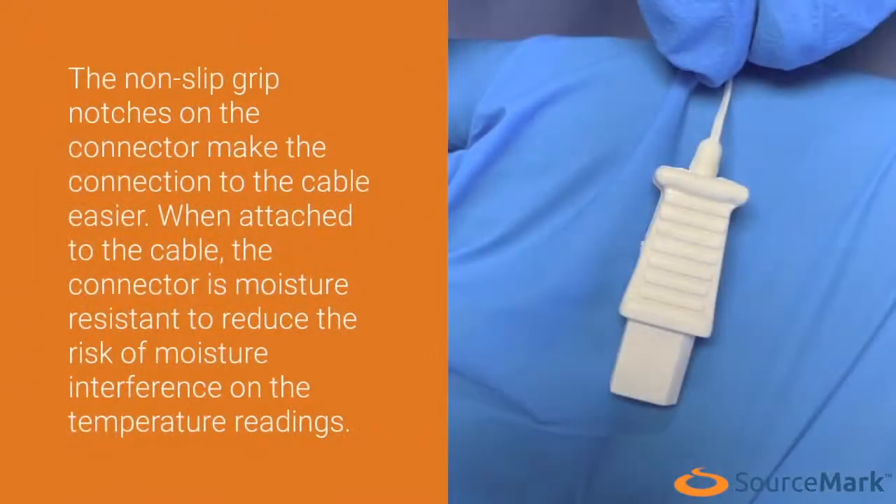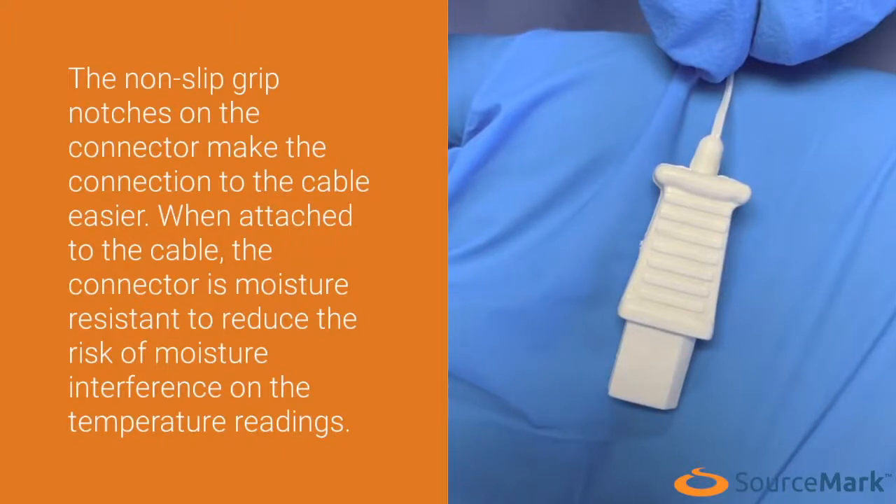The non-slip grip notches on the connector make the connection to the cable easier. When attached to the cable, the connector is moisture resistant to reduce the risk of moisture interference on the temperature readings.